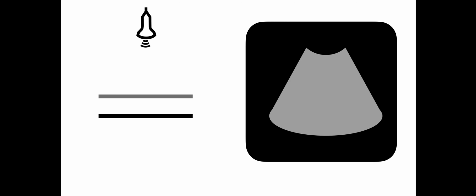But it's even more than that. The ultrasound doesn't all hit that surface and reflect, some will pass through. So some will reflect and come back to the transducer, and another part of that ultrasound or the sound wave will continue onto the far field and will hit another surface where it's reflected, and both of these will make their way back to the transducer, and depending on how long it took to get back to the transducer, it will create a dot on the screen.